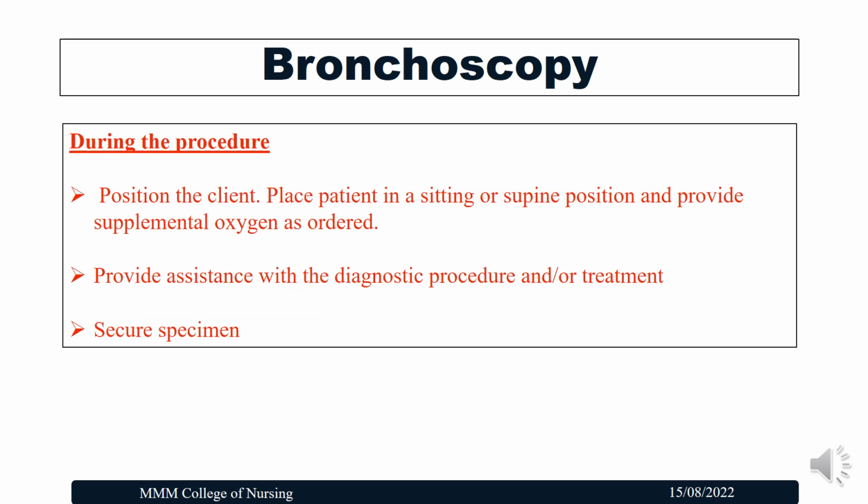So during the procedure, what is the nurse's responsibility? Place the patient in a sitting or supine position and provide supplemental oxygen as required, and always connect the patient to the monitor. The patient's vital signs should be monitored throughout the procedure. Provide assistance with diagnostic procedures or treatment. And once the specimen is collected, secure the specimen, label it, and send it immediately to the laboratory.